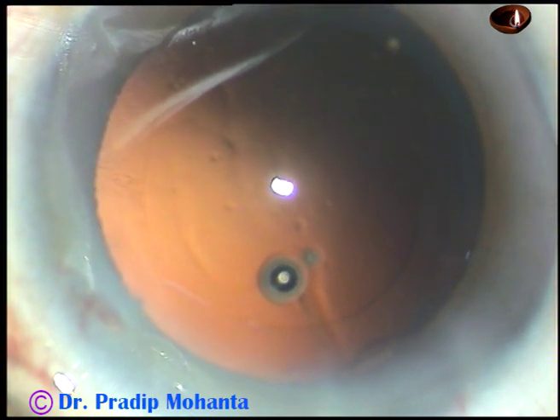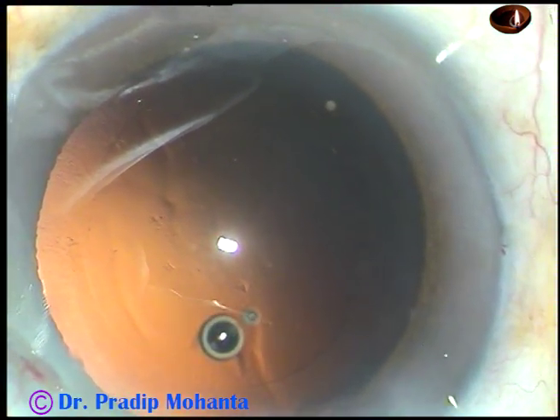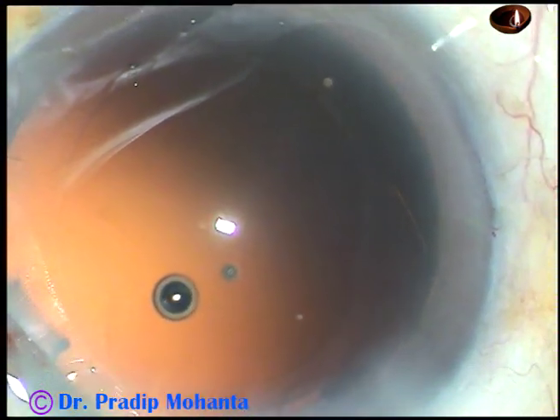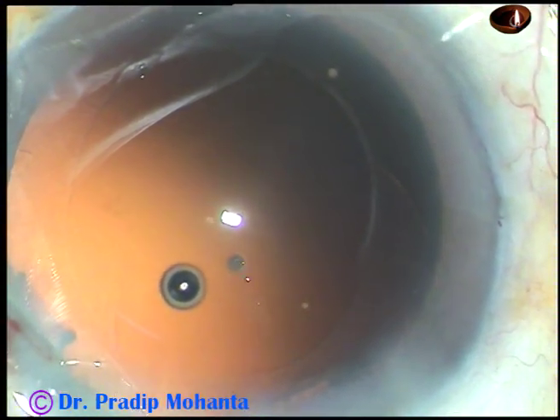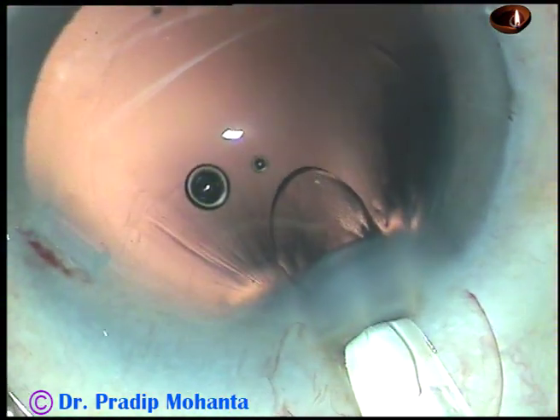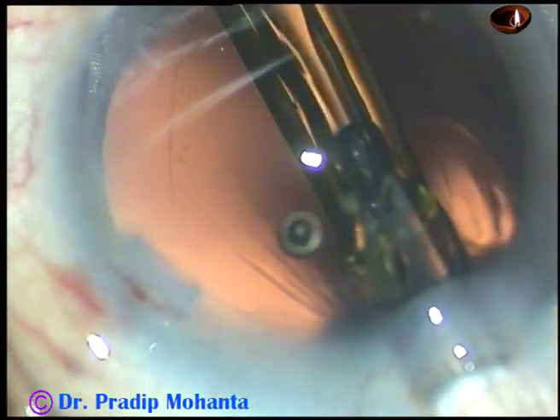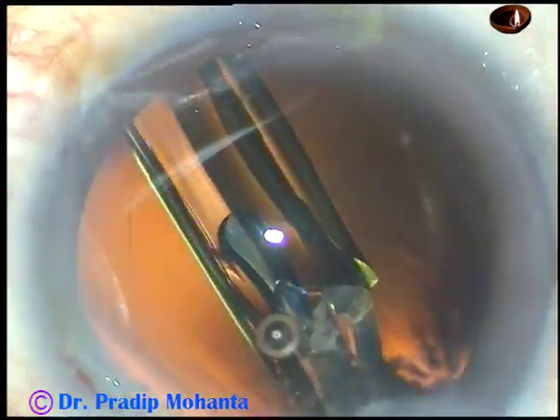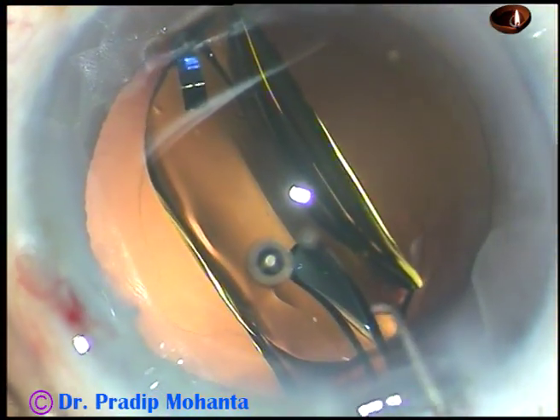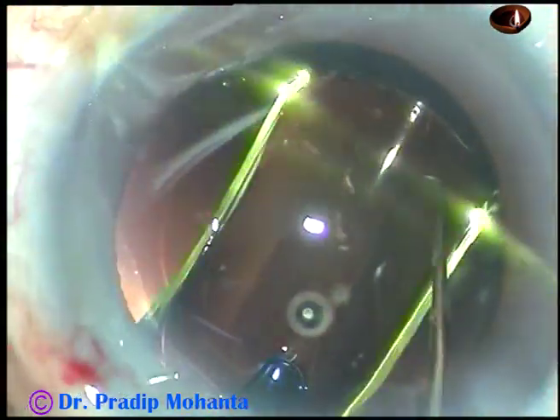And now the intraocular lens is to be implanted in the capsular bag. In this case we have selected the Hoya ON50 — it's a non-aspheric, hydrophobic, monofocal intraocular lens. And here goes the lens. The lens is now in the capsular bag.